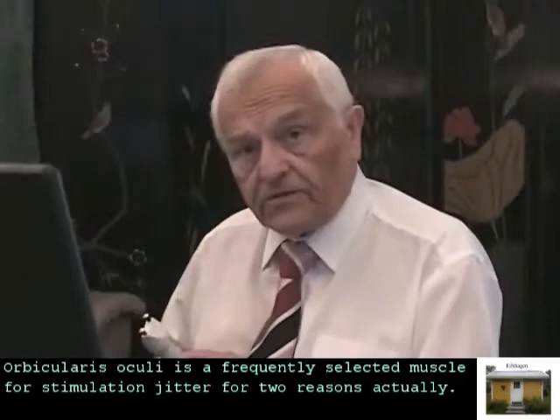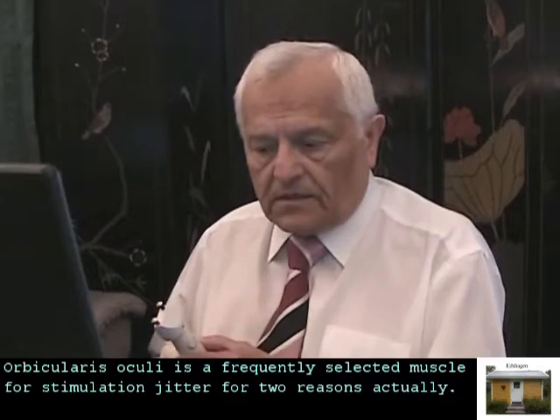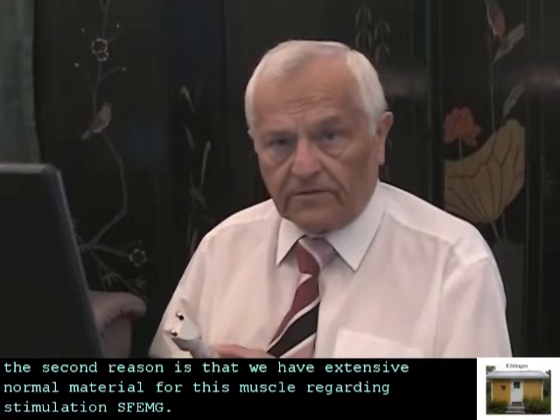Orbicularis oculi is a frequently selected muscle for stimulation jitter for two reasons. One is that it is one of the most sensitive muscles for the diagnosis of myasthenia, and the second reason is that we have extensive normal material for this muscle regarding stimulation SFEMG.